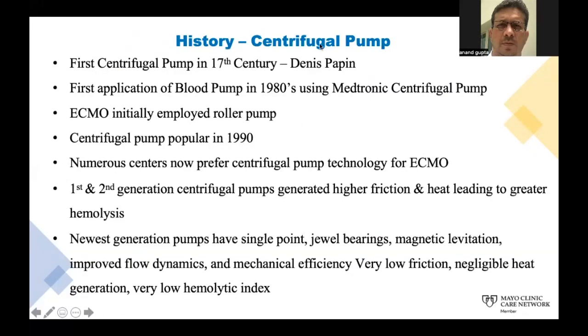The history of the centrifugal pump: the first centrifugal pump was used in the 17th century by Denis Papin. The first clinical application of a centrifugal blood pump was in 1980, using the Medtronic centrifugal pump.